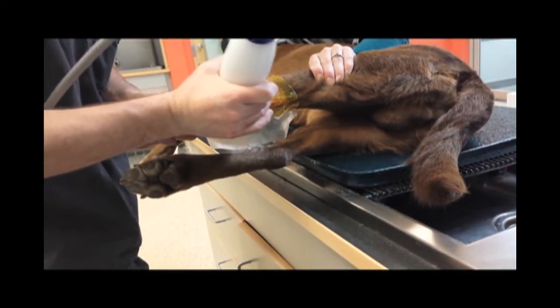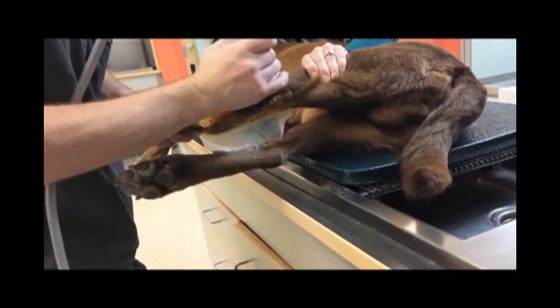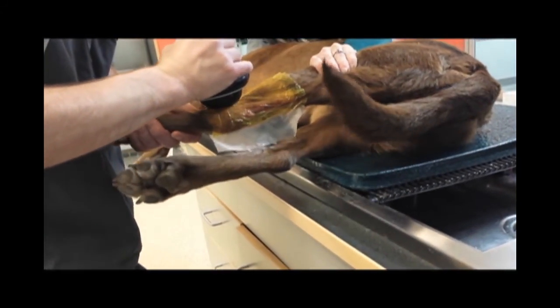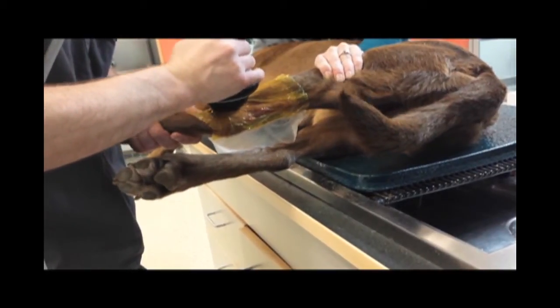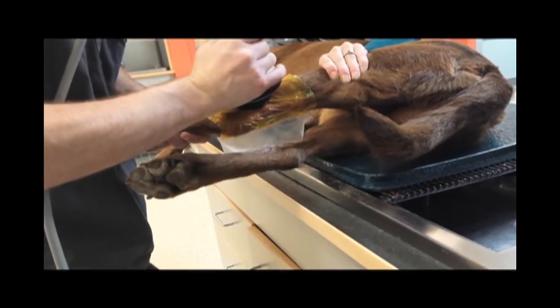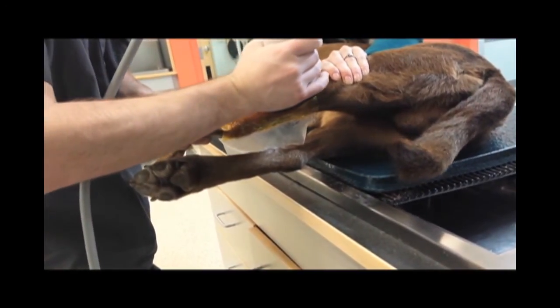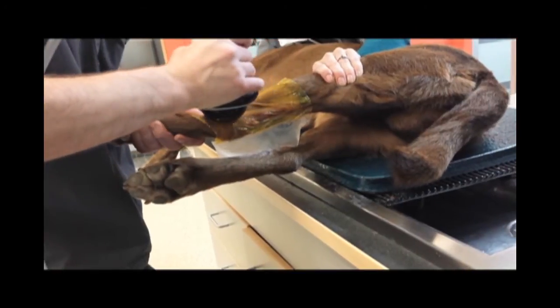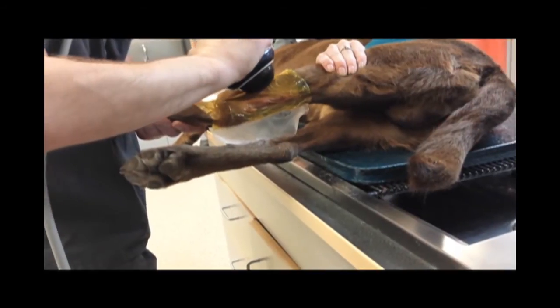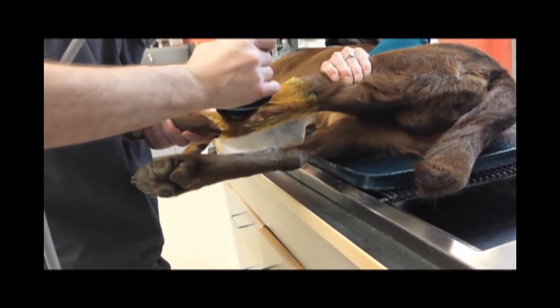The Versatron has been shown to enhance healing in a number of different situations, but most recently for the common ACL surgery, the tibial plateau leveling osteotomy. The device sends high-energy acoustic waves through the tissues, and cells at the site are turned on and produce healing proteins. An example would be bone morphogenic protein. The procedure is non-invasive and relatively inexpensive.